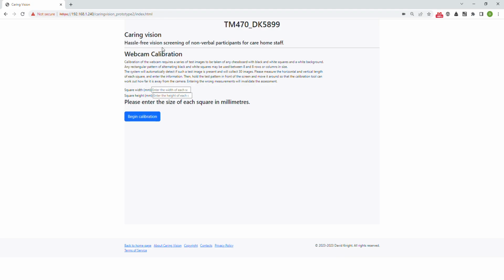So we're going to select the webcam, and then it's going to take me straight onto the webcam calibration page. The webcam calibration phase is really important because what we're trying to do is map the image that we're seeing on the webcam to a real life measurement. So we want to know exactly how large the objects are that the webcam can visualize. To do that, we use an object of known size, and that object is the chessboard. So we're going to document the square width and the square height. Some target test patterns don't actually have equal width and height, so for some patterns it is important to put a separate width and height in. But on a chessboard, you're looking at squares, and therefore they're going to be the same. This particular chessboard has a width of 30 millimeters, so we're going to put that in there.